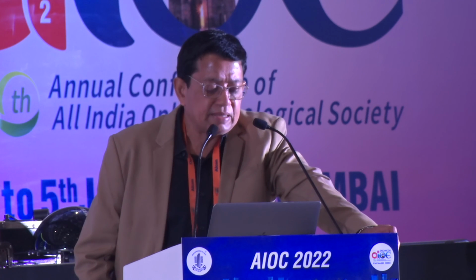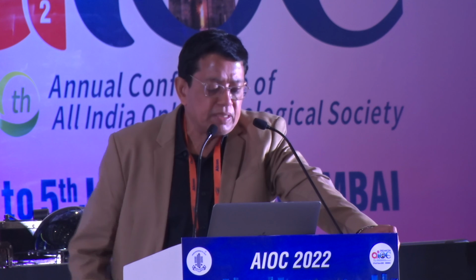So in summary, I think optical biometry would be the way to go, but just in case you do not have access to it, go ahead and use immersion A scan. And even if you use the immersion A scan, do have access to and understand the latest generation IOL power formulae. And I do strongly believe, whether it's premium intraocular lenses or simple cataract surgery, emmetropia for all is a real possibility. And as cataract surgeons of the third millennium, you owe it to your patients and yourself to achieve it. Thank you so much for your kind attention.